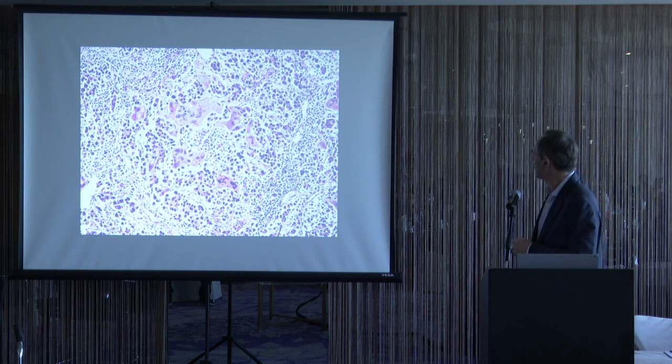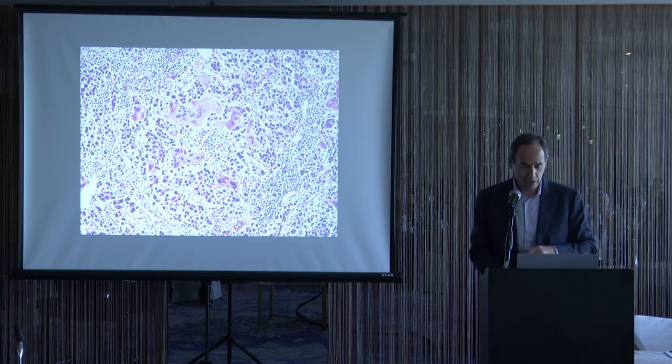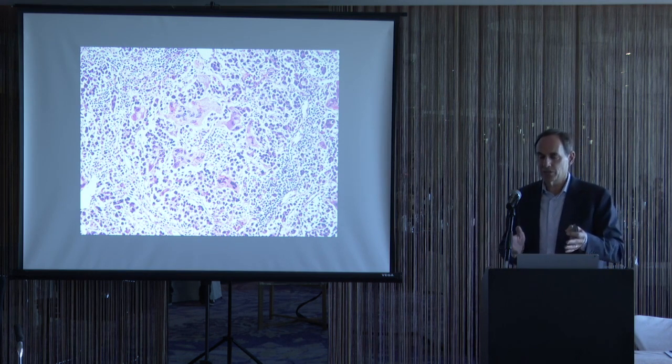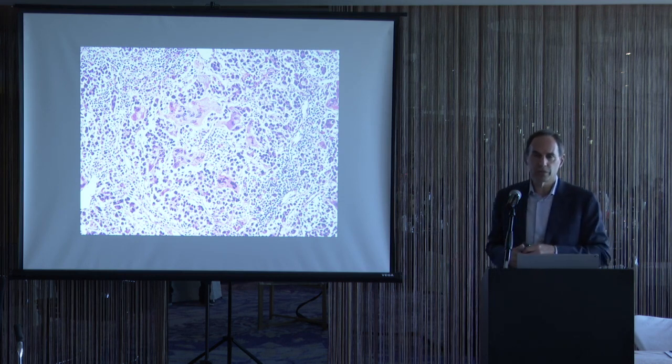We don't see any cytotrophoblasts. The cells around the syncytial trophoblasts are just these loosely cohesive seminoma cells. But, a lot of these syncytial trophoblasts, that would bump up this serum HCG. And so it's important to report these because the clinician will then correlate your findings of syncytial trophoblasts with a minimally elevated HCG. It'll reassure them that there is no choriocarcinoma in the specimen.